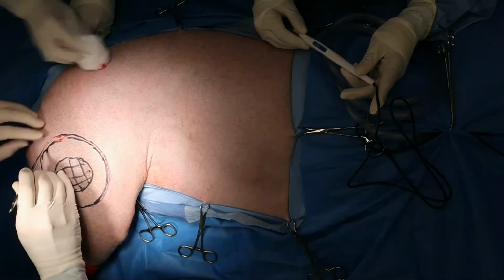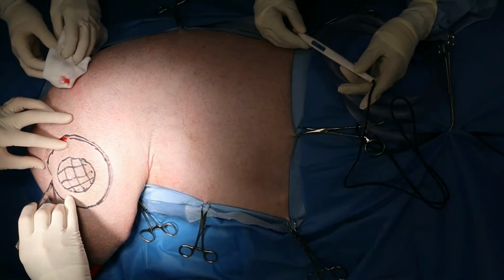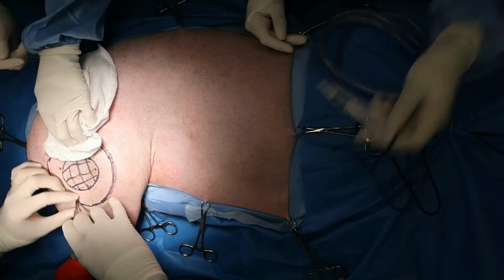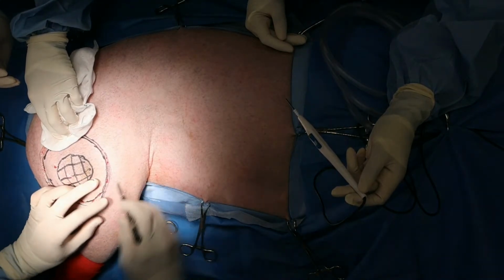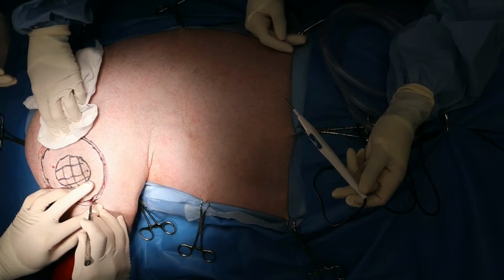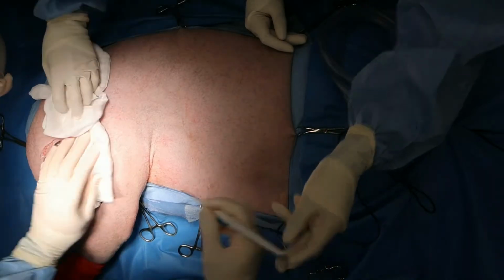So I go through the skin using my blade, and then I usually use my electric cautery for the rest of the dissection. And you'll see that in this case I'm probably going to have to take out a substantial portion of the thickness of the biceps muscle. And I have found over the years that the dogs really don't need their biceps muscle.